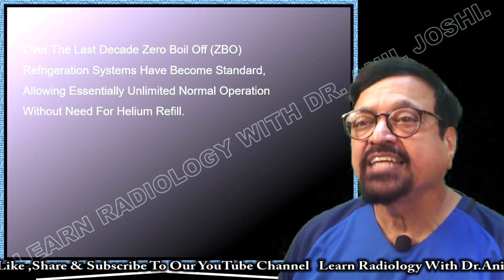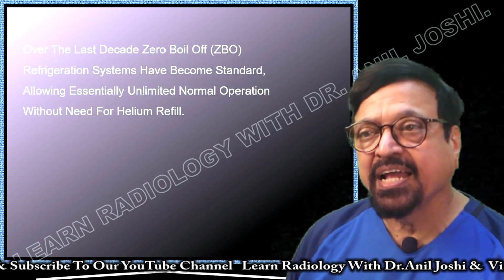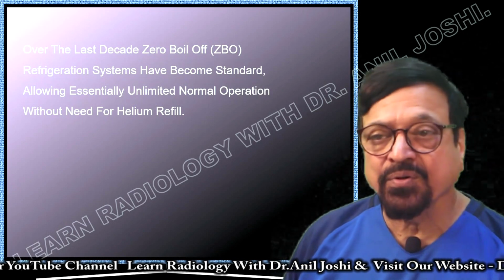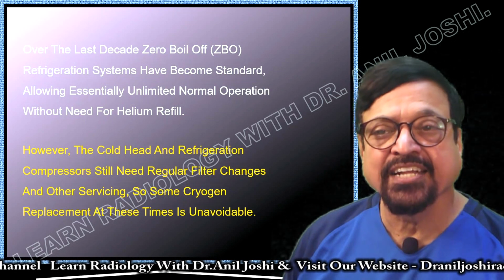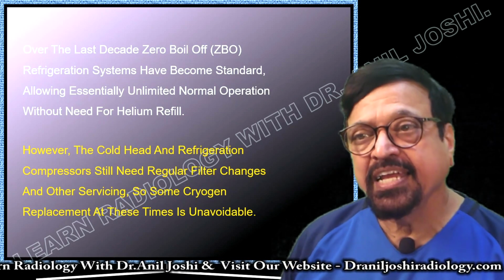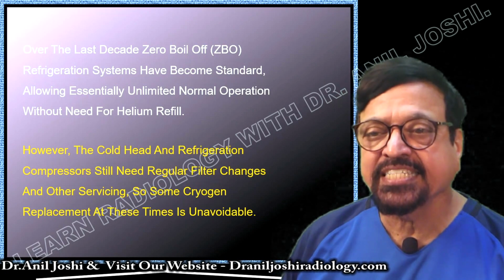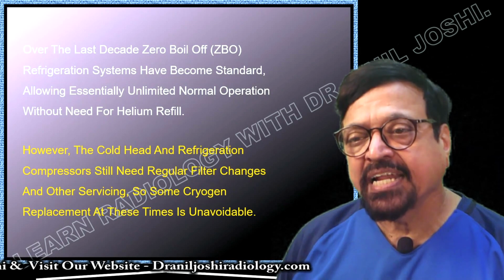Now, how is it achieved? Over the last decade, the zero boil off refrigeration system has been standardized, allowing essentially unlimited normal operation without the need for a helium refill. So it retains the helium and does not lose it. There is no loss of helium. However, the cold head and refrigeration compressor still need regular filter changes and servicing.